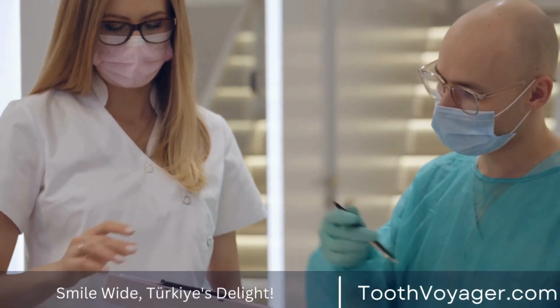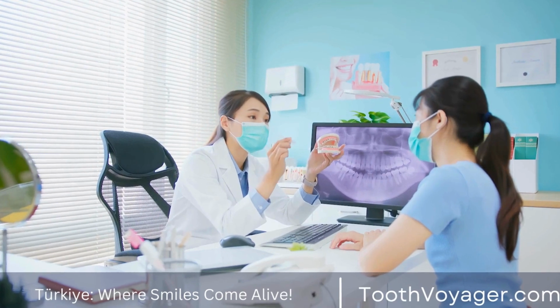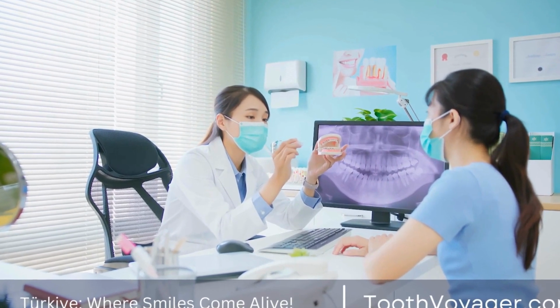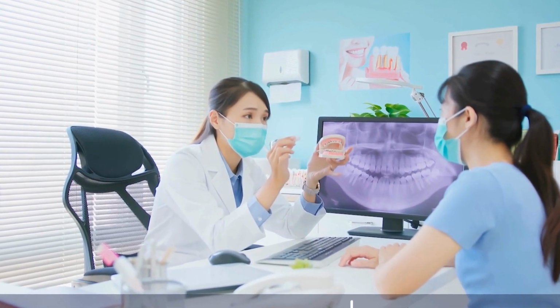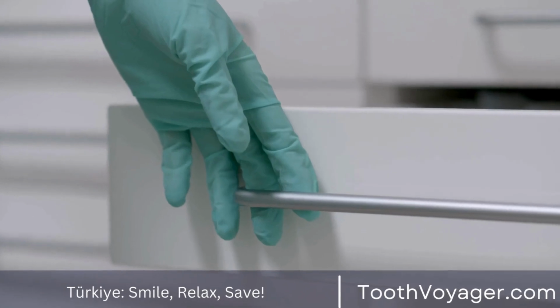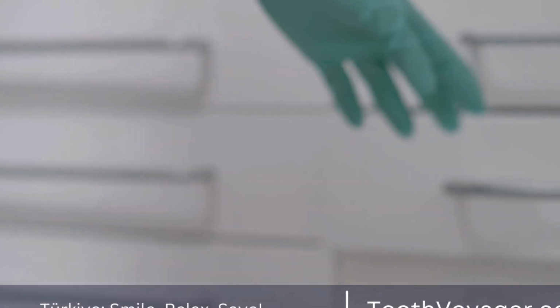2. Subperiosteal implants. Subperiosteal implants are less popular, but still a viable option for those who don't have a healthy jawbone that can accommodate endosteal implants. Instead of being inserted directly in the jawbone, subperiosteal implants are installed over the bone, however they are placed beneath the gum tissues.